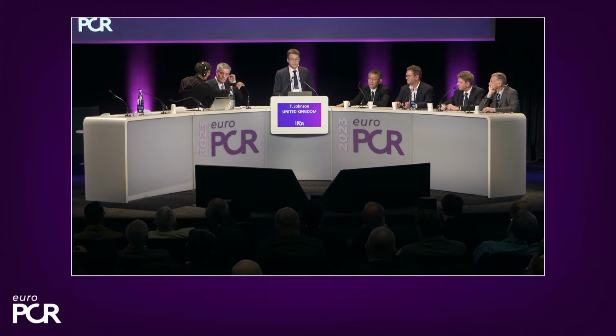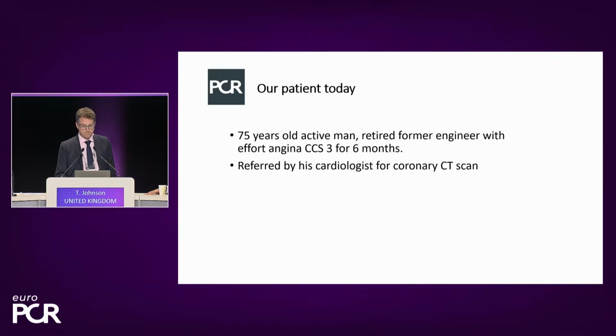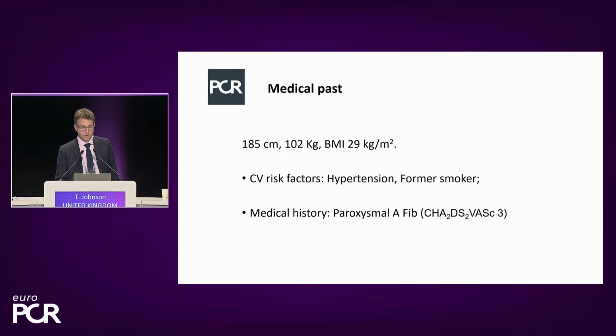So this is a case of distal left main trifurcation with additional bystander disease in the mid-LAD, as we said, broadcast from Massy. So our patient is a 75-year-old gentleman, active, former retired engineer, with CCS class 3 symptoms over the last 6 months. As is practice, certainly for us in the UK, he has gone through a CT scanner prior to coming to the cath lab.